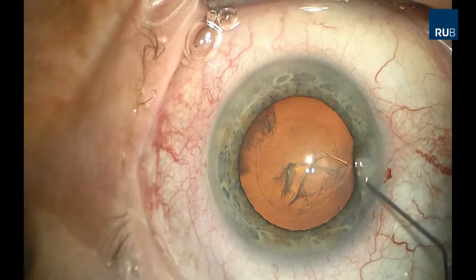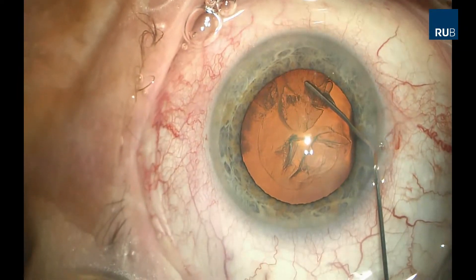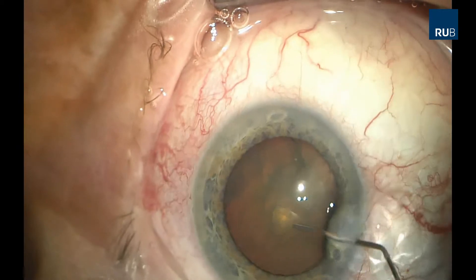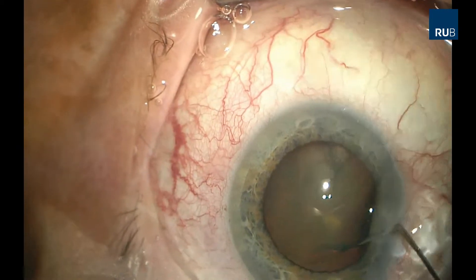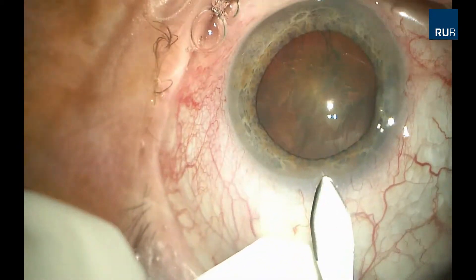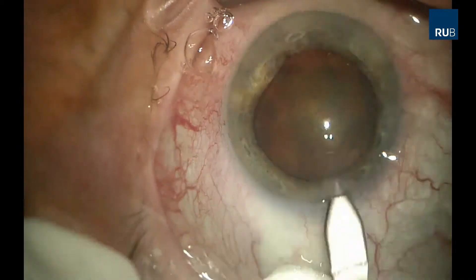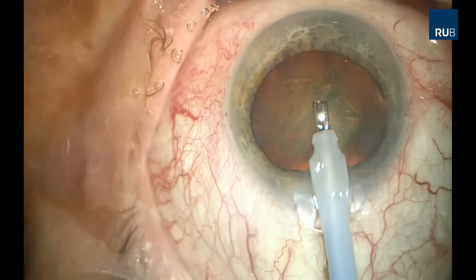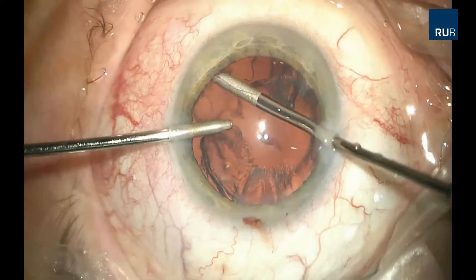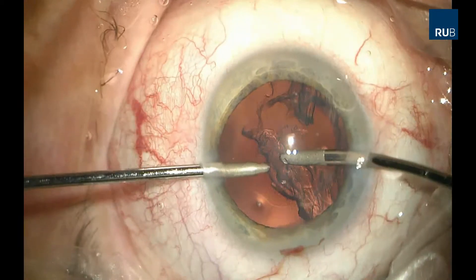After hydrodissection, a 2.75 millimeter main incision is completed and the phacoemulsification handpiece is used to remove the lens. Residual cortex is aspirated bimanually with the irrigation and aspiration handpieces.